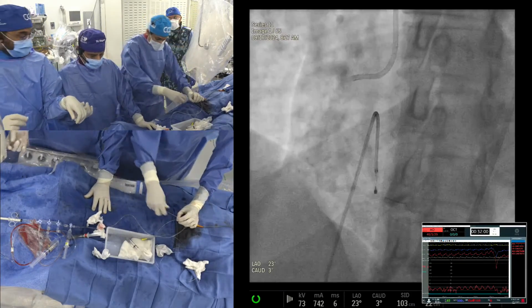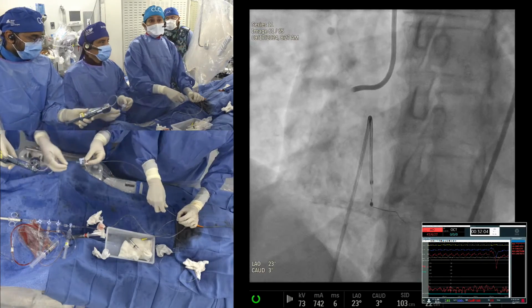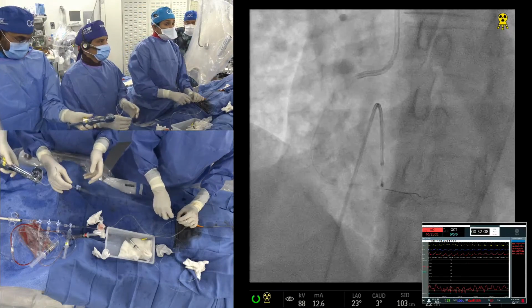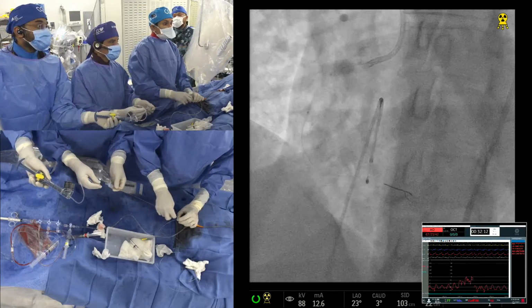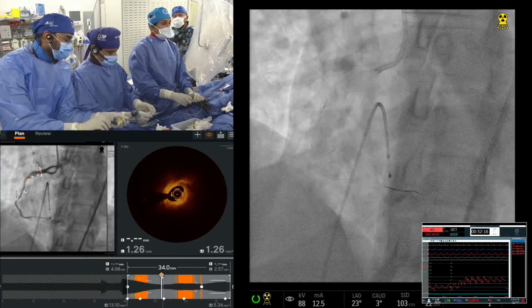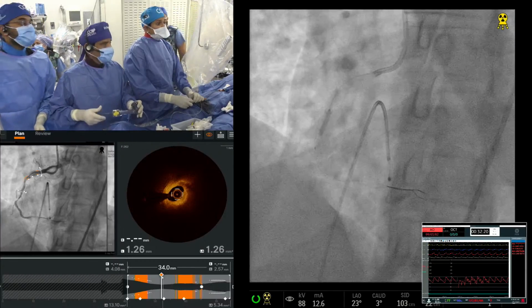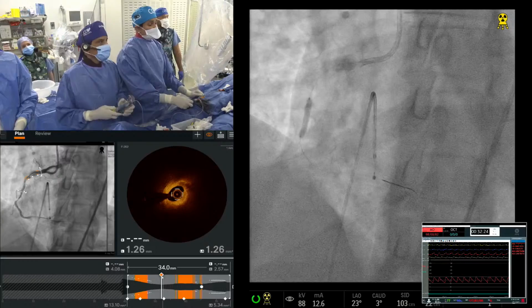Dr. Kini, actually there's also lipid plaque, a combination of lipid and calcium. Go back and show them where there is lipid. Some part is deep calcium and some lipid plaque on it. So maybe our goal is to address the lipid plaque and the distal embolization. A 3.5 by 48 synergy. Balloon dilatation itself will also help.